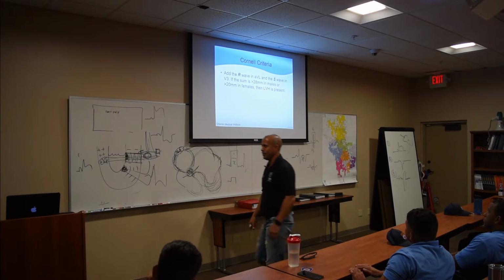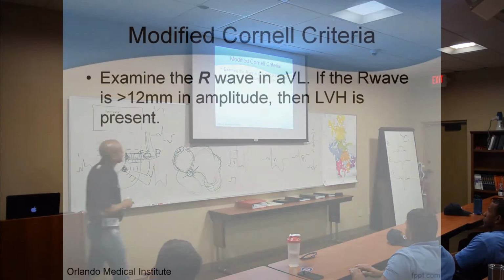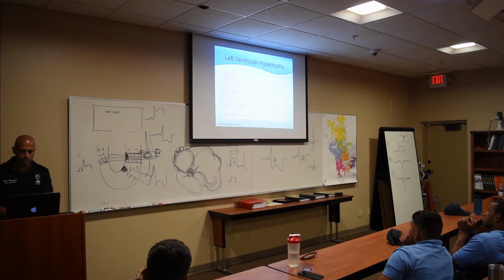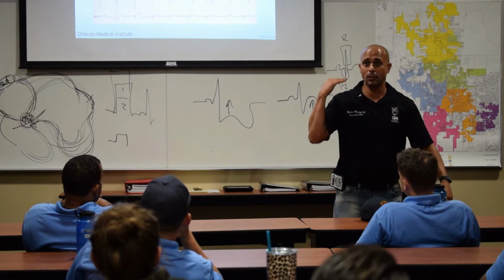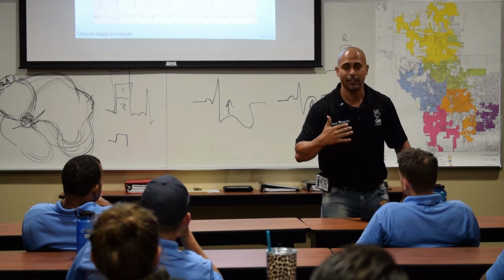It's crazy. Who remembers that? So they said that's a little crazy, extreme. Let's modify it. Just take that R wave in aVL. If the R wave is 12 millimeters or more, you have LVH. That's a little easier, right? Go to aVL, count how many little boxes it is. You could do that. But as you get older, those little boxes become dots. And after you get to the third one, you can't see the fourth or fifth. You're back to counting from 1, and you screwed up.